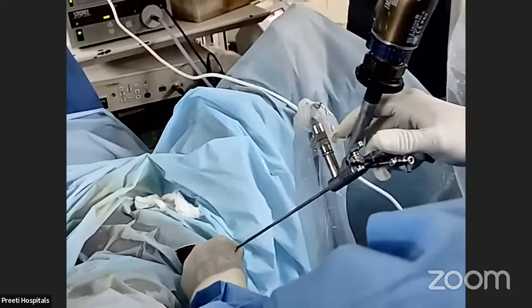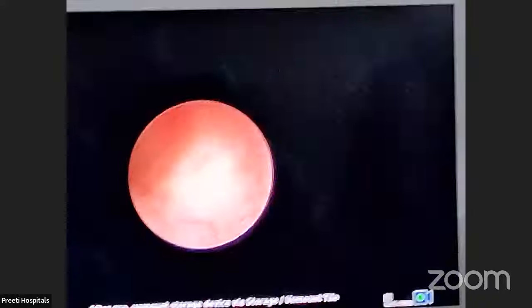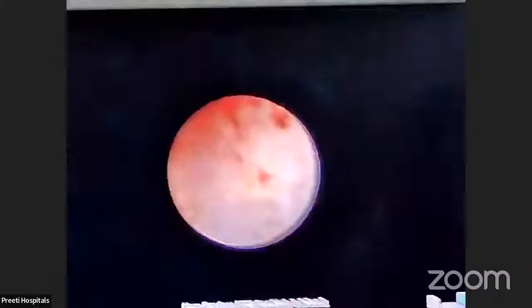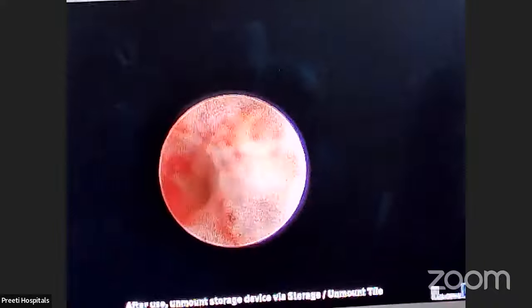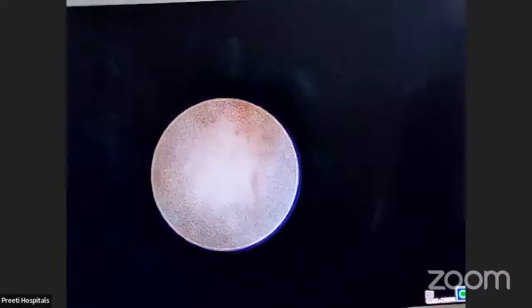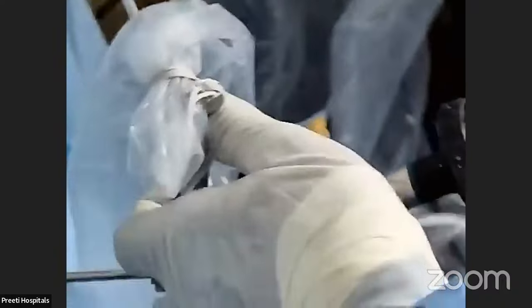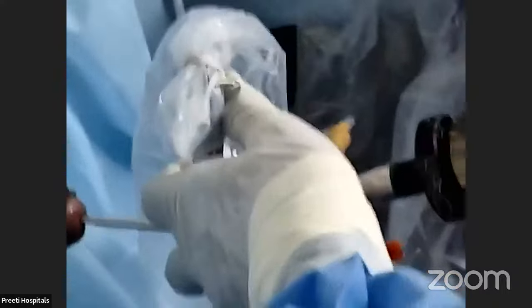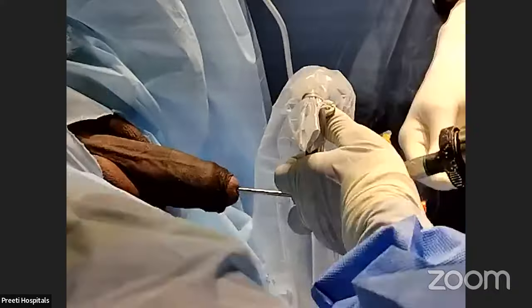Okay. So this is the ureter, not at all any damage. Only thing is that it is slightly tight. So I will keep for 2 minutes. The ureter is very, very accommodating. There is no problem. So I will keep it for some time like this, wait, and give me the head back. Take one more new access sheath. So I will take the access sheath again. I will try once again. But I have not done any damage to the ureter.